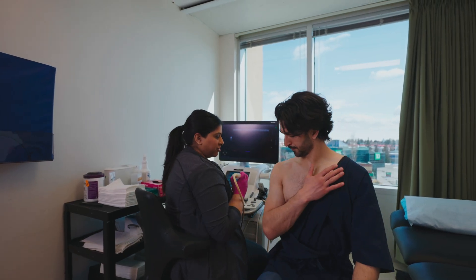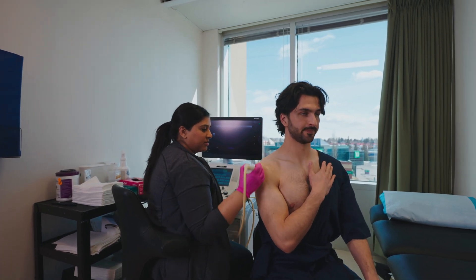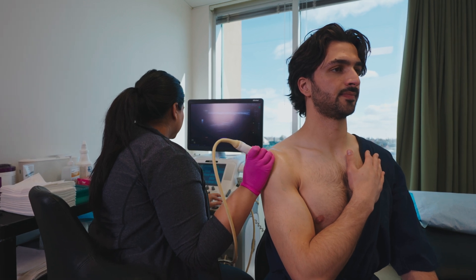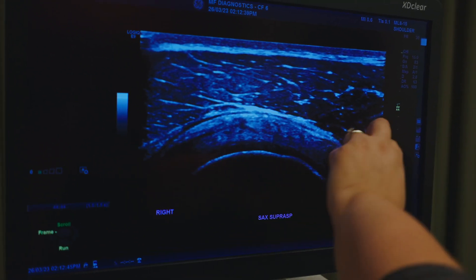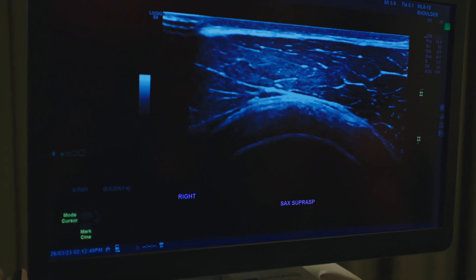I'm going to get you to just place your hand onto your chest. I'm just going to turn you a little bit away from me here. So this here is the bone — that's your humerus. This up top is the tendon. Right on top of the tendon is the bursa. That's the muscle, and then a very small layer of skin and fat at the top.